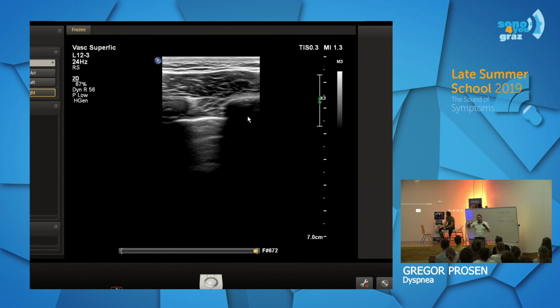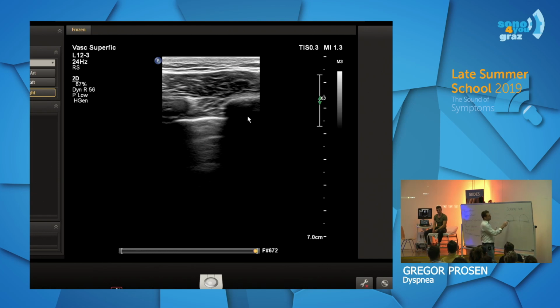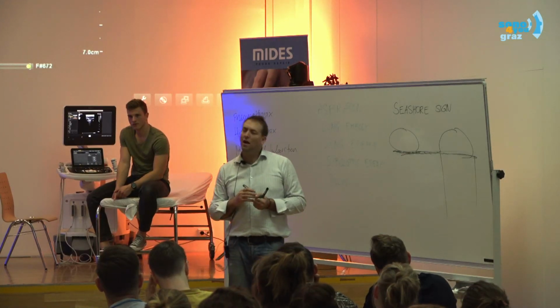Okay? Because, now bear in mind, before you said some hyperechogenic lines. Well, how do you know that this hyperechogenic line is pleural line? Because it's moving. Okay. How else? How about if it's not moving? How do you know then? Because behind it, there is nothing. Yeah, okay. We can see nothing.